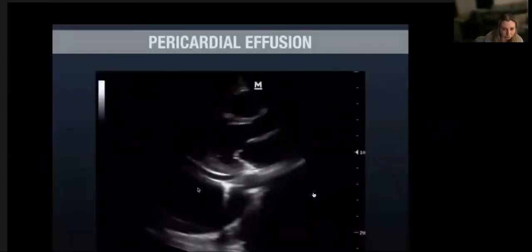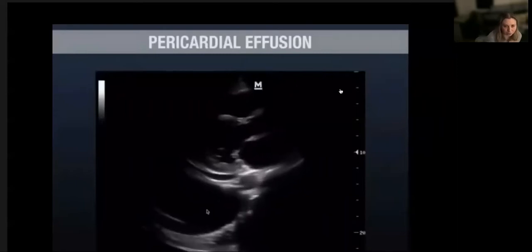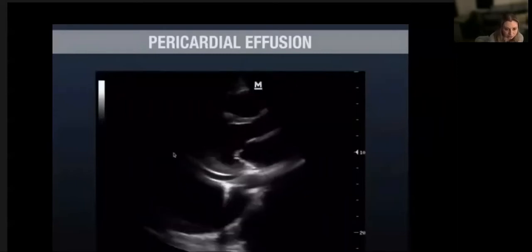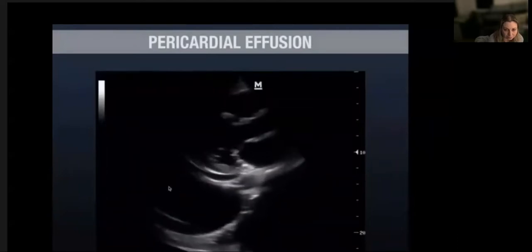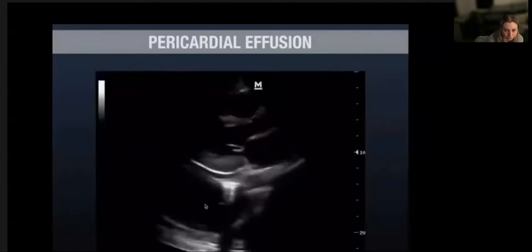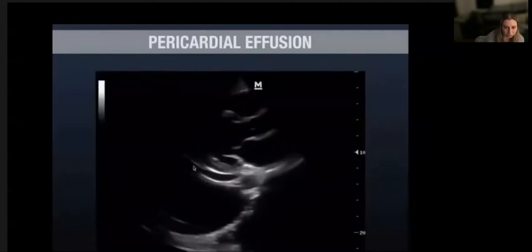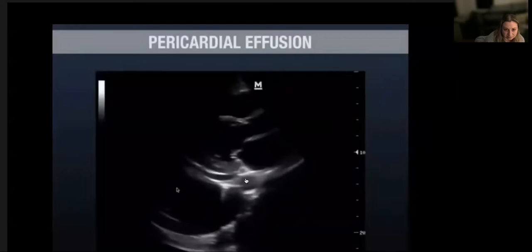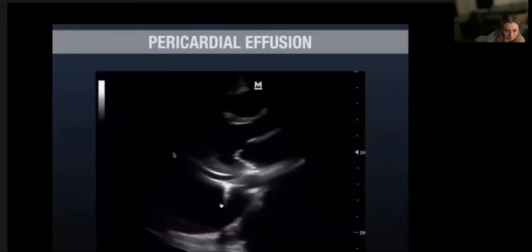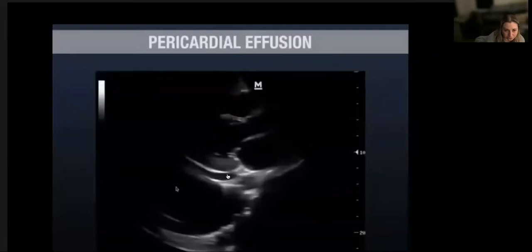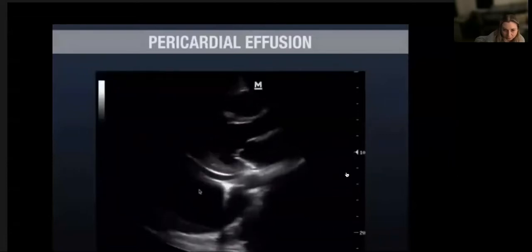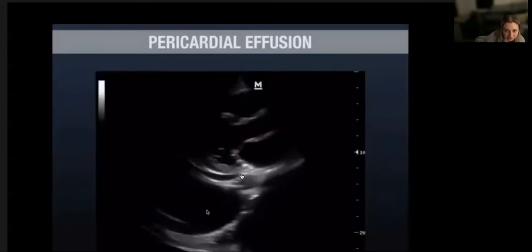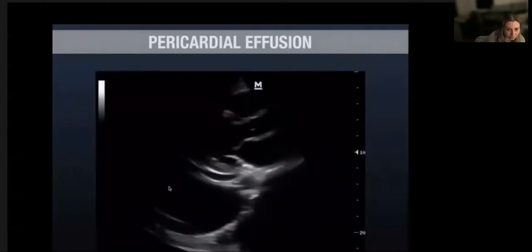What's this one? It says pericardial effusion at the top, but have a look and see what you think - put any thoughts in the chat. Pericardial, pleural, or both? We've got this big anechoic area abutting the descending aorta but dropping down below, suggesting pleural. However, there's also a smaller sliver of fluid about half a centimeter coming up anterior to the thoracic aorta, so that's pericardial. This unfortunate patient has both a pleural and a pericardial effusion.